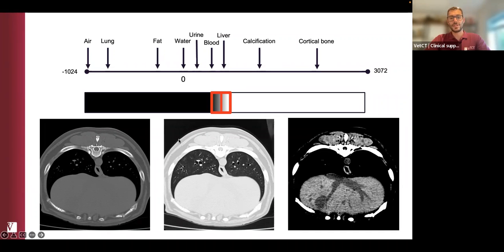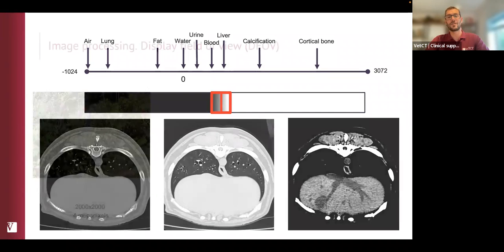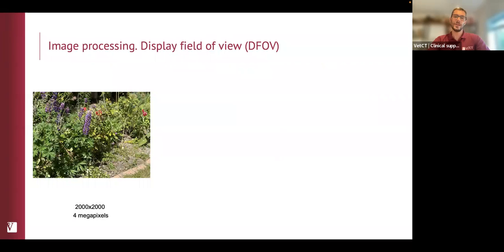But for example, these two images on the left, they are identical images. These are not different series. It's the same image. We've just changed the contrast and brightness. So I know it's a bit confusing. We've got filters for one side, which are the series that you get out of the scanner. And then to each of those you can apply hundreds or thousands or millions of windows to each of the images, but they are different things.